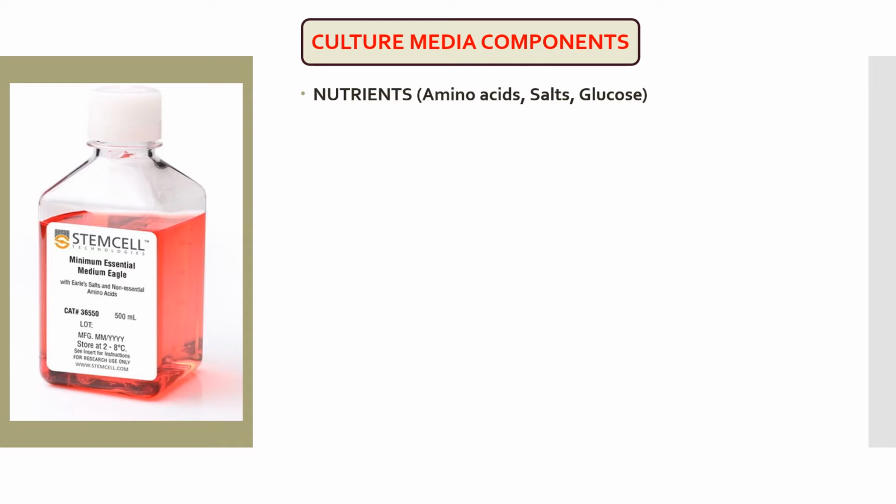Inorganic salts are also essential components of a culture medium, since they are the nutritional precursors for macromolecules and regulators of intracellular charge. Divalent cations like calcium ions are required for cell adhesion and in signal transduction. They can also influence whether cells will proliferate or differentiate. Sodium, potassium, and chloride ions regulate membrane potential, while sulfate, phosphate, and bicarbonate ions are anions required by the cell matrix. The culture medium also provides glucose as the main source of energy for the cells.